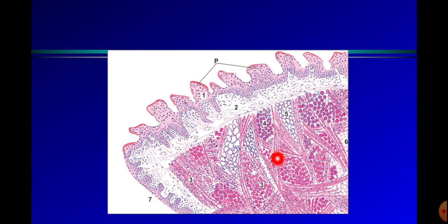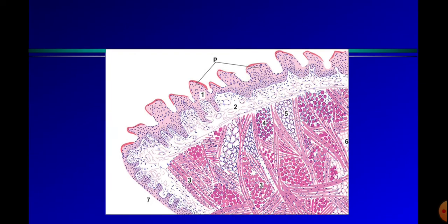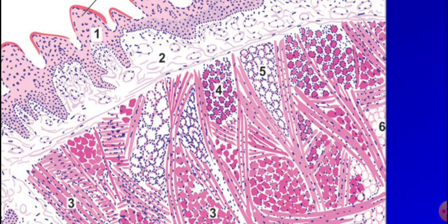Okay, so here all the views of the muscles, the longitudinal section as well as the transverse section, can be seen forming the main substance of the tongue. These are the different muscles present here. We can find the longitudinally cut muscle and the transversely cut muscles. Along with the muscular part, we can differentiate another tissue. These are the glands.